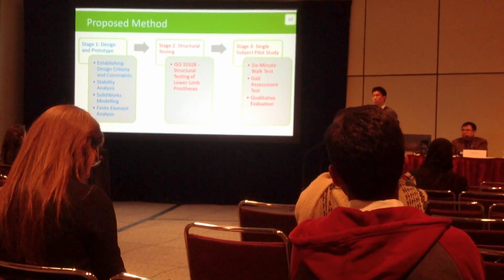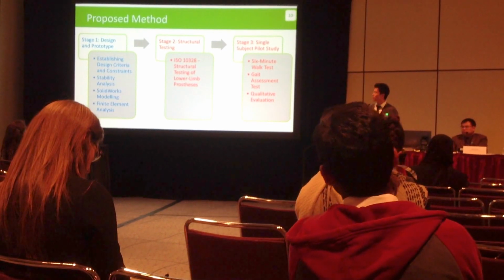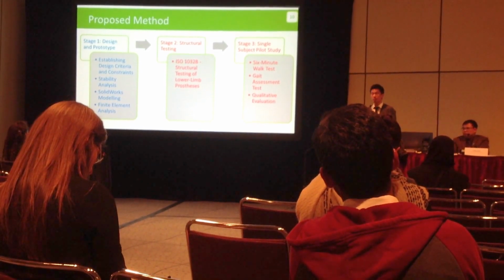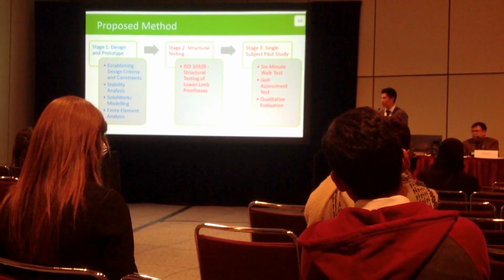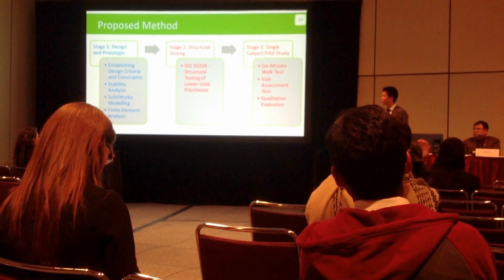And here's the proposed method for my project. The project can be divided into 3 different stages, which are design and prototyping, structural testing, as well as a single subject pilot study. We have just recently completed the design and prototyping phase, where the knee joint has been made, and we're going to move into stage 2 and stage 3 very soon to test it out.